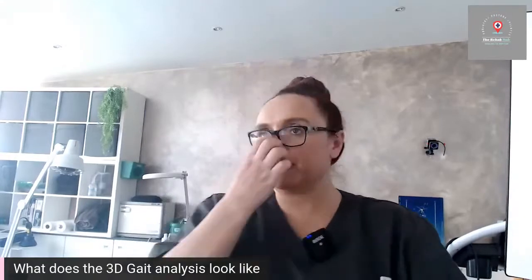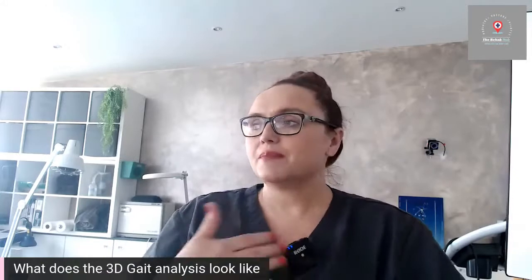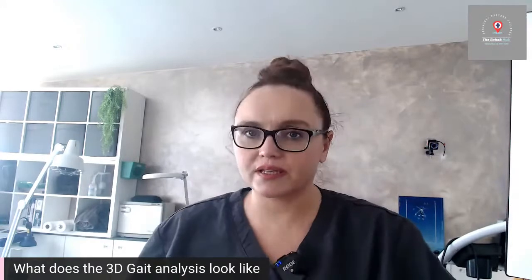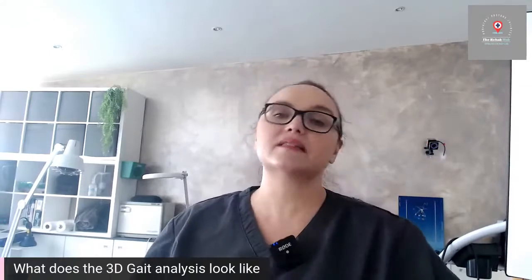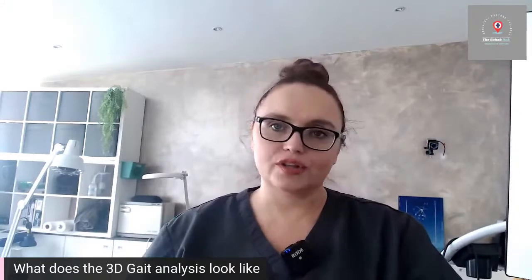If you're in pain, or if you've got an injury, or if you're running and you're getting niggles, basically anybody who walks, so you don't need to be a runner to do this. If you're maybe a hill walker as well, and you're getting wee tweaks, maybe it's your lower back, maybe it's your hips, maybe it's your knees, and you want some answers because you want to know why that is happening, then this is the most accurate assessment that you could get.